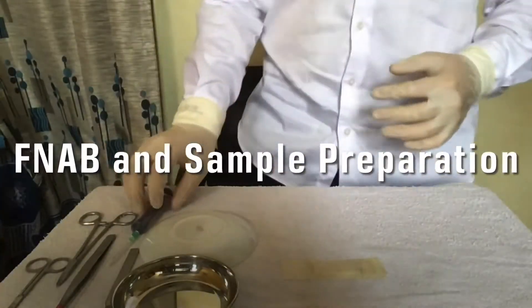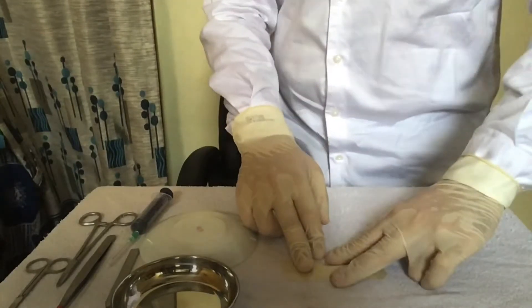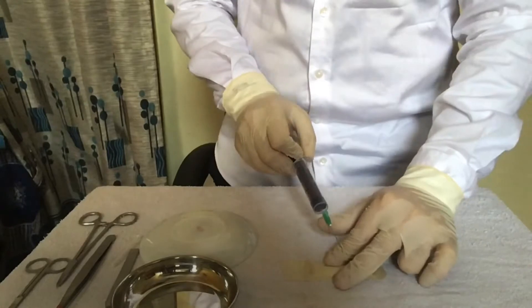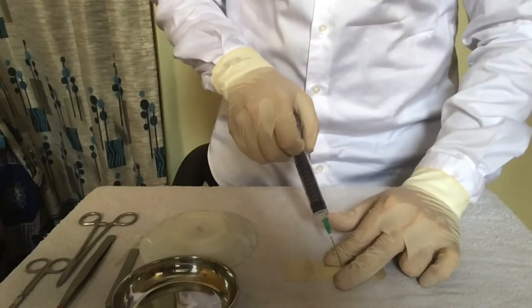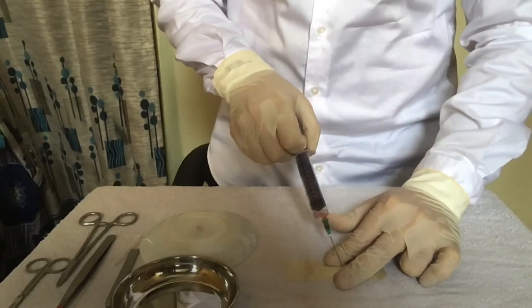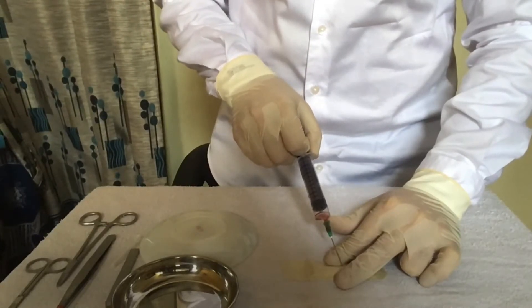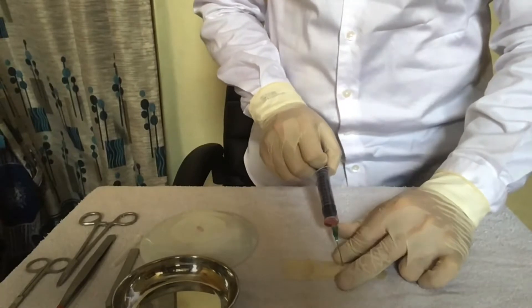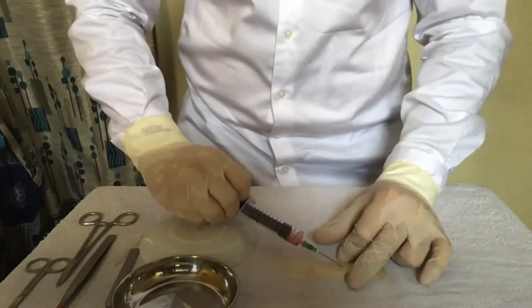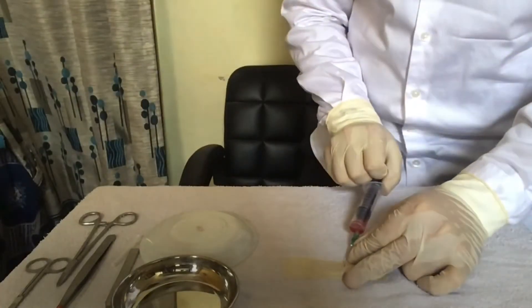For FNAB, prepare the site and locate the node or mass using your fingers. After locating, get a 10ml syringe and push it gently into the tissue. You can move the syringe back and forth to collect the sample, and also in all directions. You can take help of the thumb of your other hand to support the syringe.